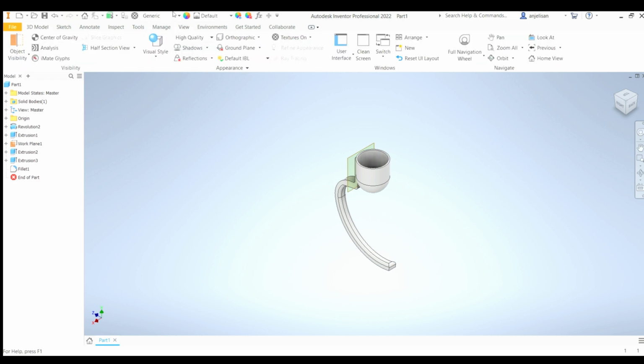So let's go to view and let's just see how it looks without the lines, and we'll go to realistic. This is probably what it would look like in real life. What do you think? We have the cup holding the person's amputation, and then we have the cheetah blade.